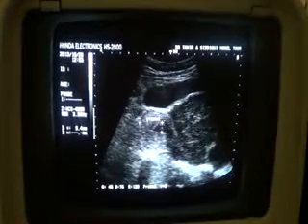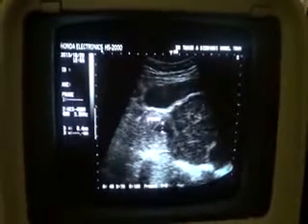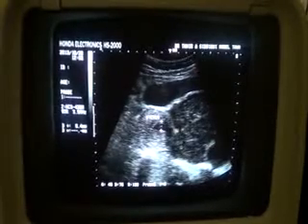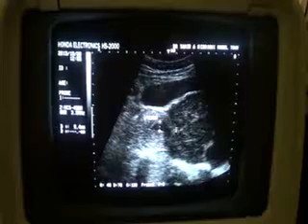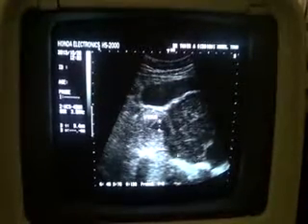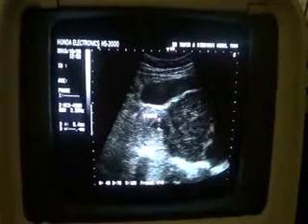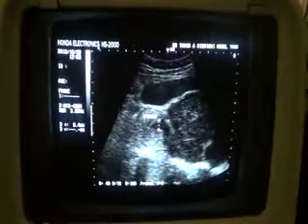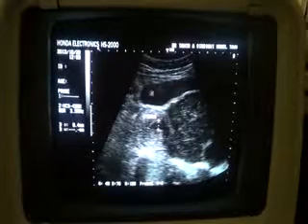This is a thin rim of fluid around the myometrium, and you now see that this anterior myometrium is thinned out because of the long-standing pressure effect from this cystic mass in the region of the left adnexal, pressing on the anterior myometrium for a long time.